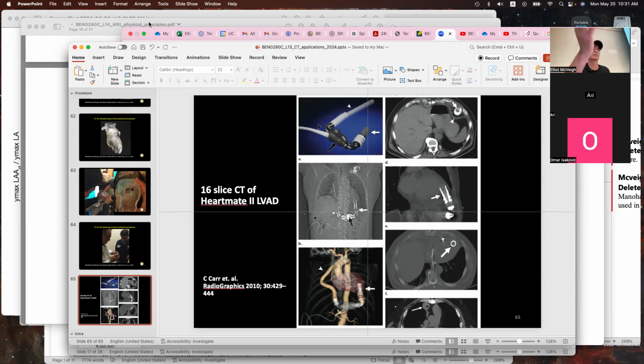And the worst case scenario is you can't pull it out with any kind of catheter-based device. You basically just have to cut the patient open and pull it out, right? So if it's surgical, you can get anything out surgically, right? Now, sometimes you are able to, and this is not common, but you can do this: if the device itself fails for whatever reason, you can put another device inside it. So let's say it's a big stent in your aorta, and for whatever reason one of the tines failed or broke or has some kind of mechanical problem, you just put another stent inside that one and open it up, right?